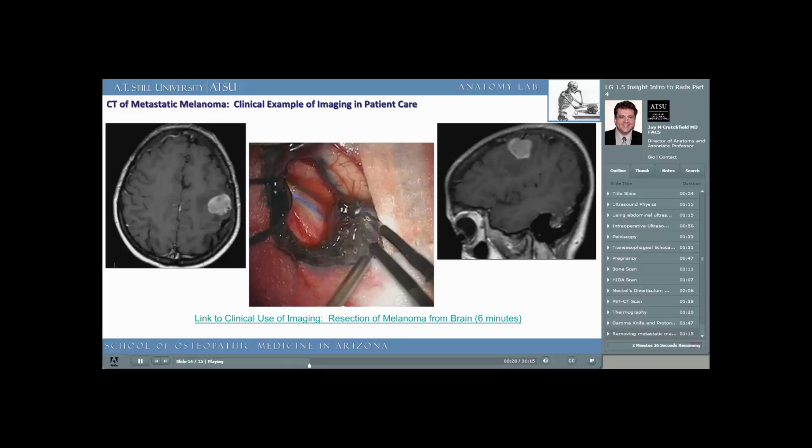If you click the link, you can watch the neurosurgeon remove the metastatic melanoma from the brain tissue. The neurosurgeon transects the dura mater of the brain, exposes the brain, and then uses fine pointed electrocautery forceps, known as bipolar cautery, to exactly cauterize the blue tissue and not the surrounding brain. As you would expect, a melanoma is blue in color because it contains melanin.